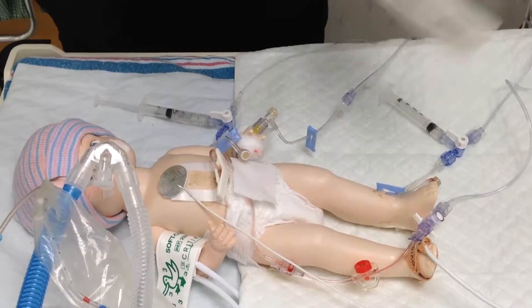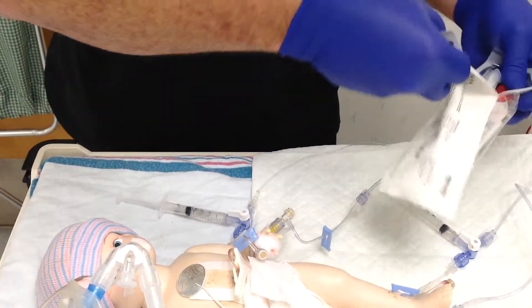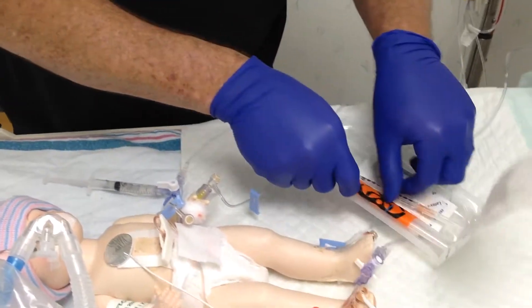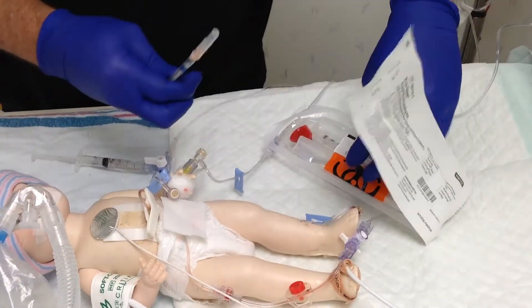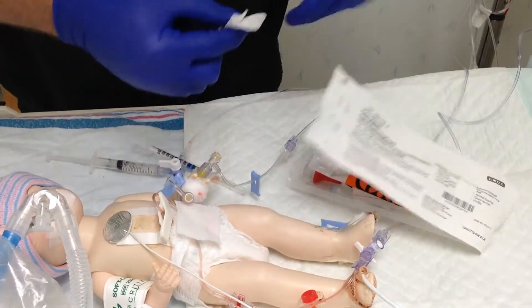The first thing you're going to notice about this site is there's two hubs. They look identical because they are. One is actually an IV, the other one is an arterial line. Make sure you select the right site. When you clamp it off, your waveforms on the monitor should go away.